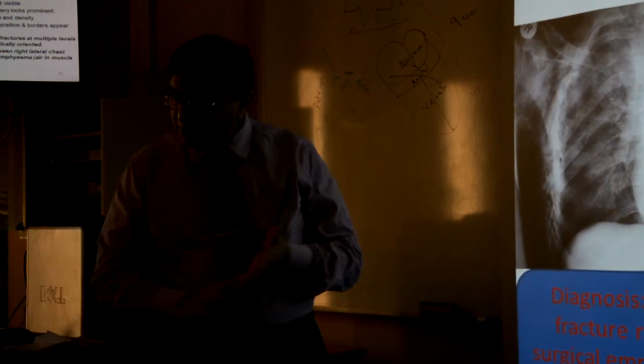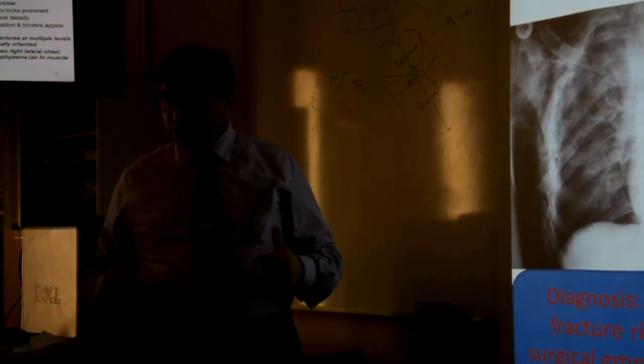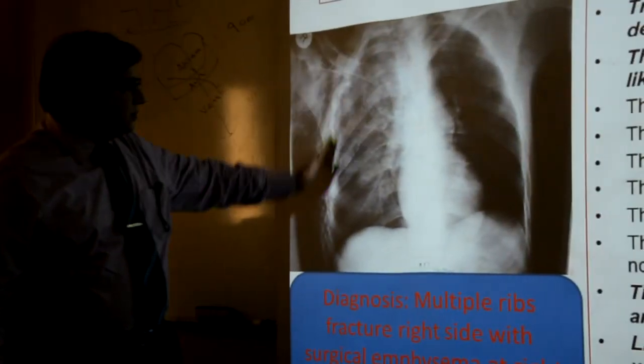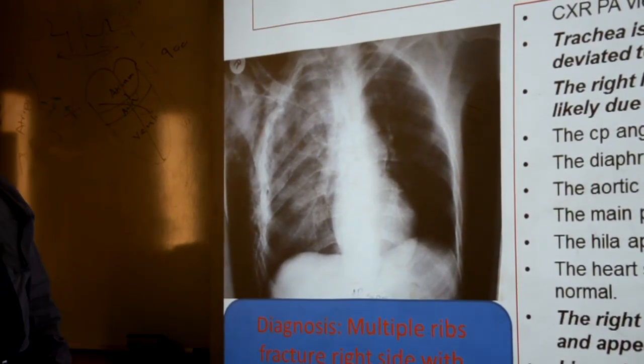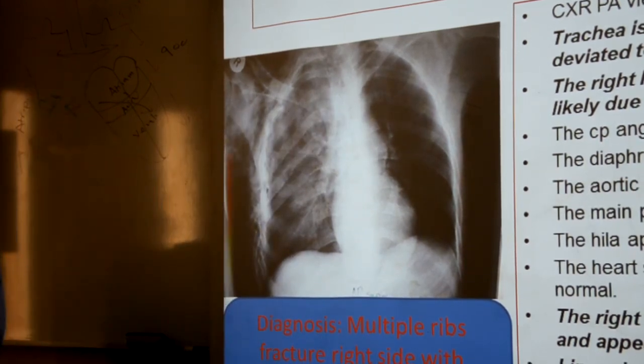So next you will always do the CT, because the big thing you want to rule out is hemorrhage. The rib fractures are not so important for confirmation, because the management would remain the same. The bad thing is the hemorrhage, which we have to exclude.